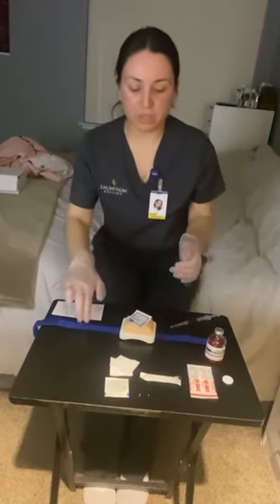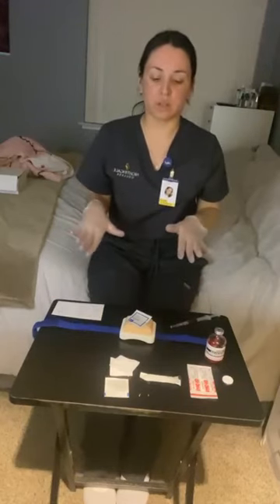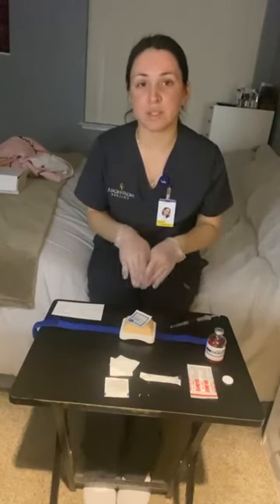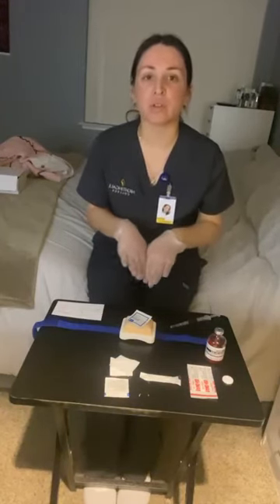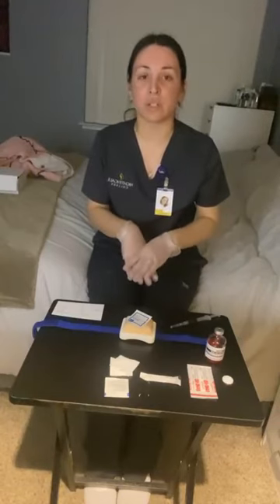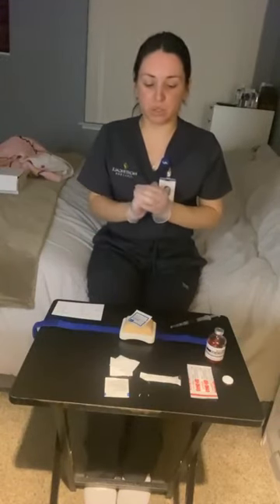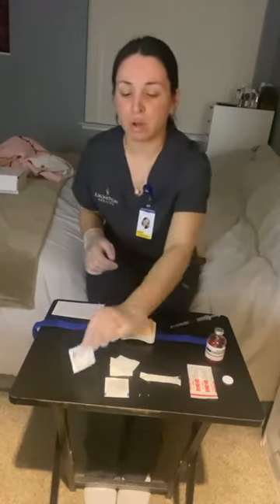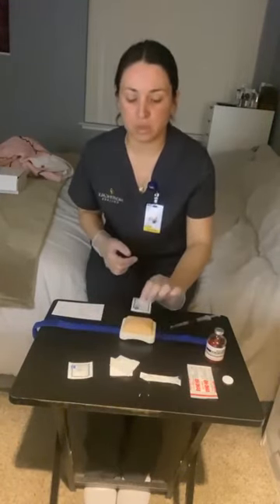I do want to make sure that there are no skin irritations, edema, or bruising prior to choosing that site. I want to palpate and make sure there is no tenderness or hardness. I do want to clean the area, so I would use a new alcohol swab, and I would start from the center, working outward about 2 inches.